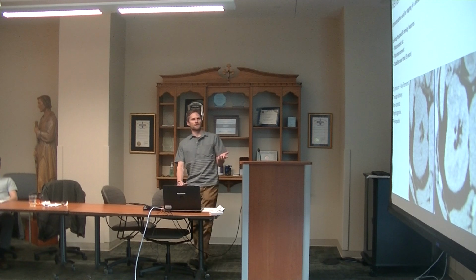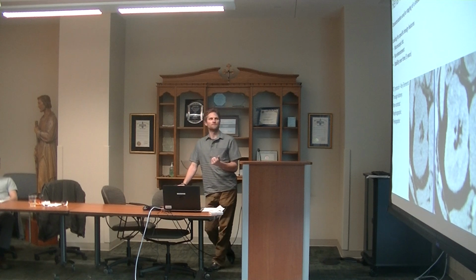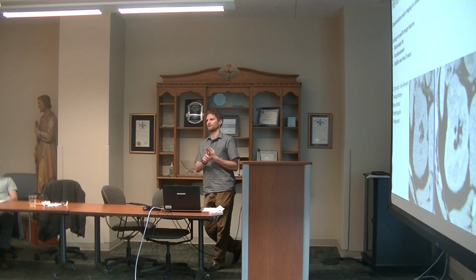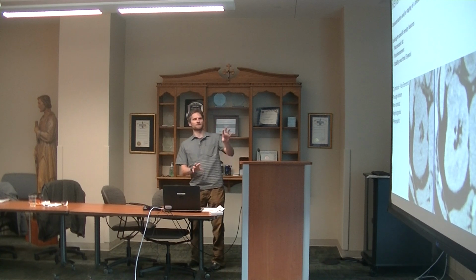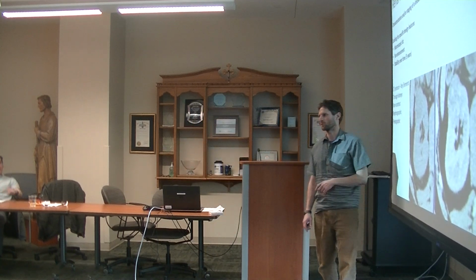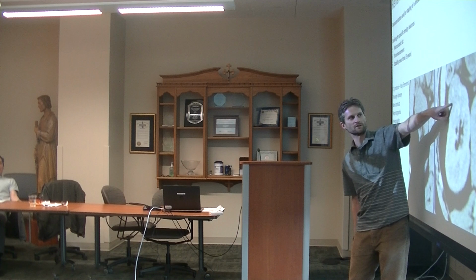So when we look at renal masses, we're looking for signs that we can call something definitely benign. In the case of renal masses, we're looking for macroscopic fat, where we can say, oh, this is just an angiomyolipoma, it's benign. Or something that doesn't enhance, since complicated cysts can have this intermediate density appearance. If you were seeing this mass just on a renal stone protocol and it measured 40 Hounsfield units, you can't tell the difference between a benign hemorrhagic cyst and a renal cell cancer.